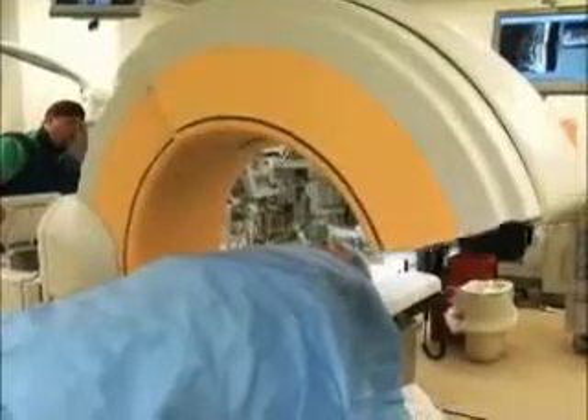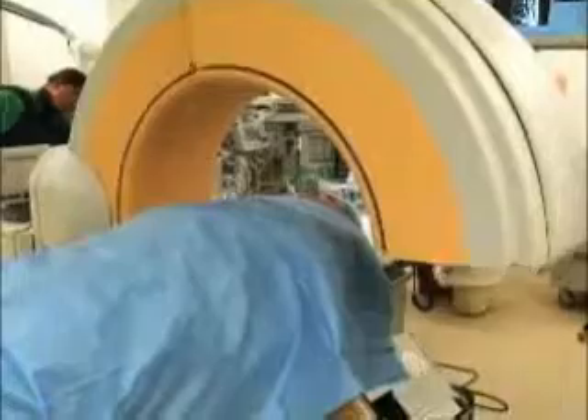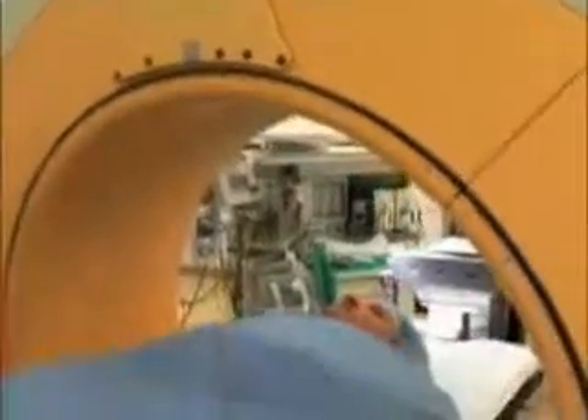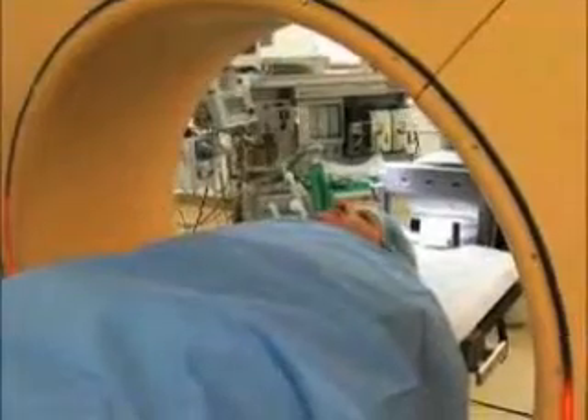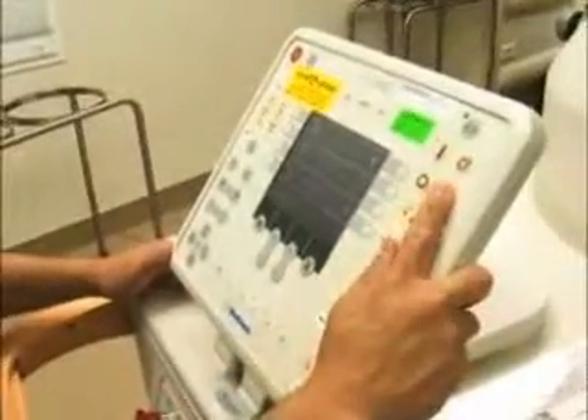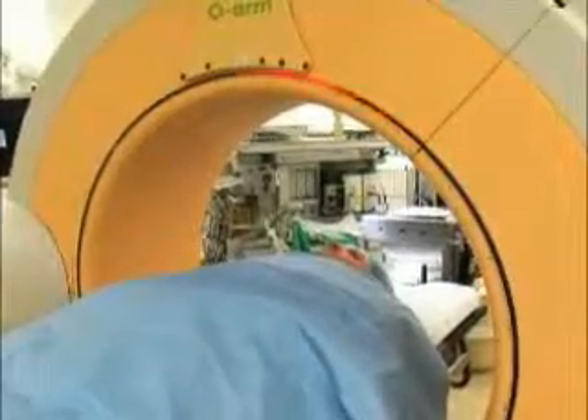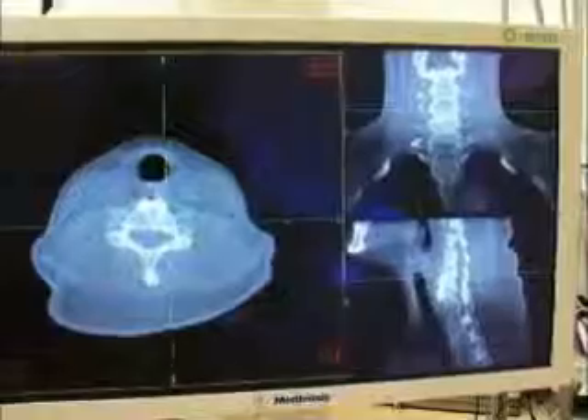The O-Arm is a new piece of equipment that allows surgeons to operate on the spine to deal with spinal-type problems, whether it be degenerative, traumatic, or of any type, in a minimally invasive way. It allows us to put in instrumentation and to do surgeries in a much safer and much more accurate fashion.